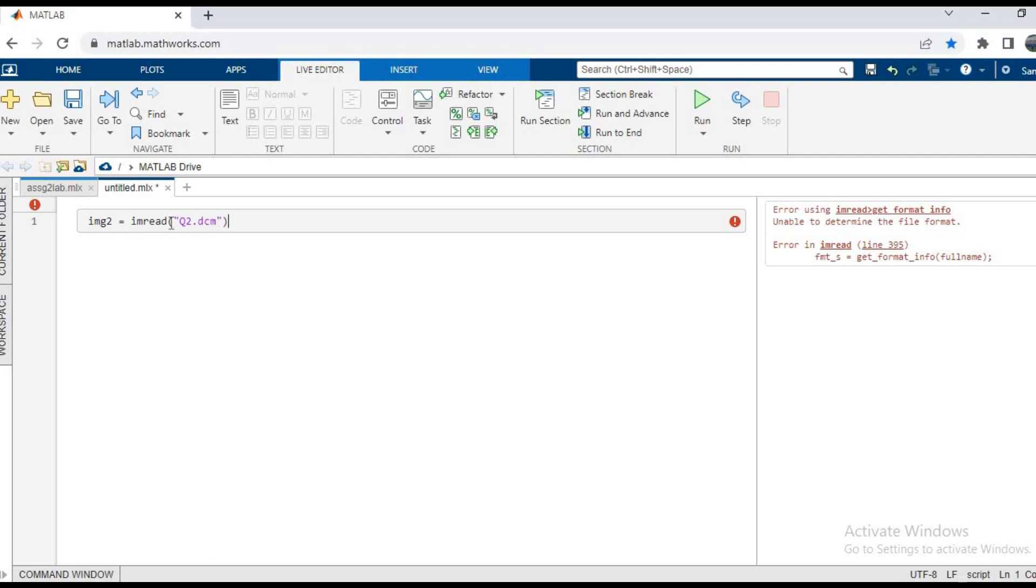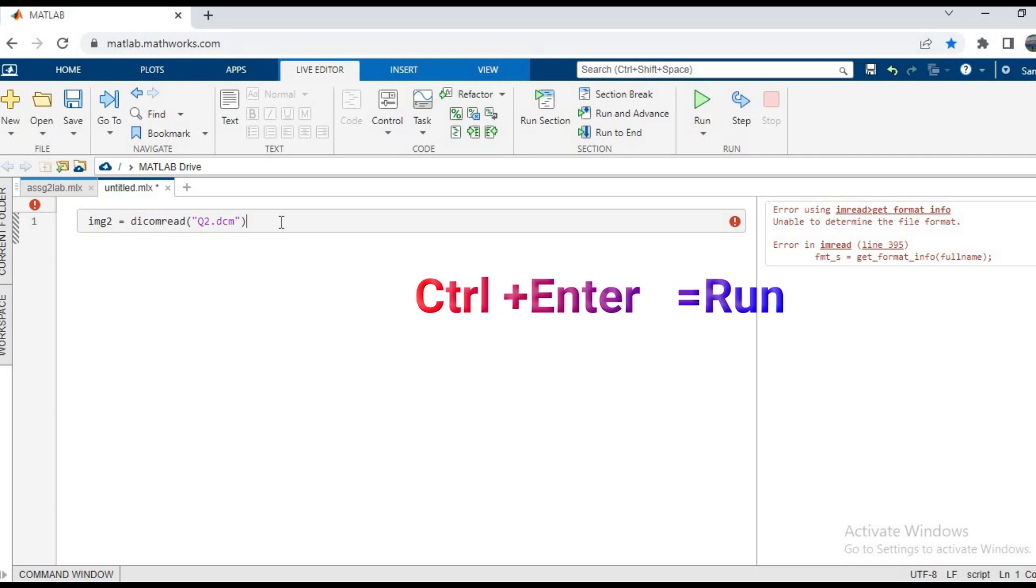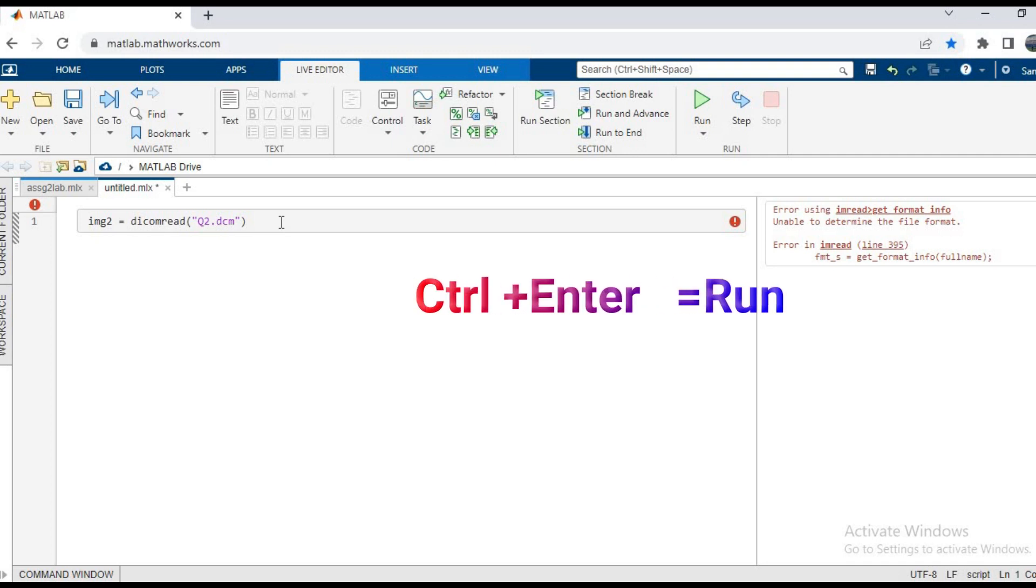And that is because DCM files cannot be read using the imread function, and we need a dicomread function to do this. So write img2 equals dicomread q2.dcm, and then again run the function and let's see what happens.